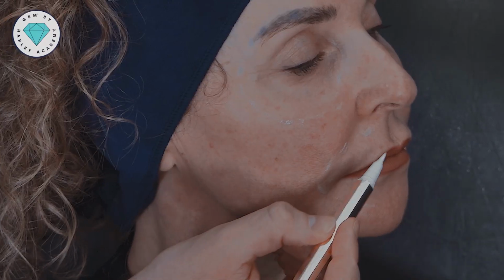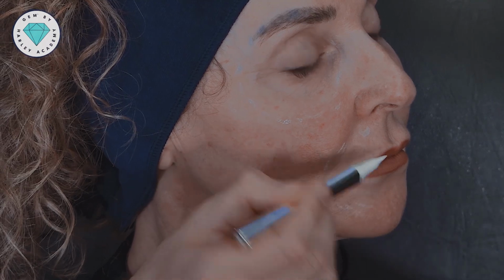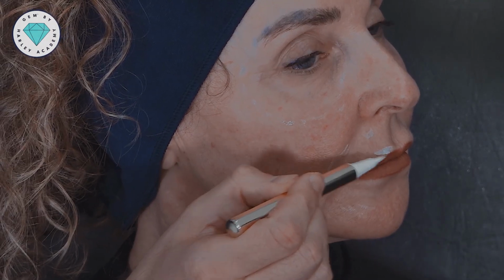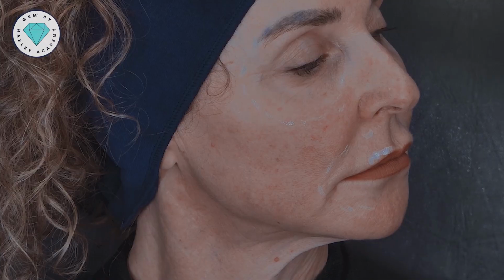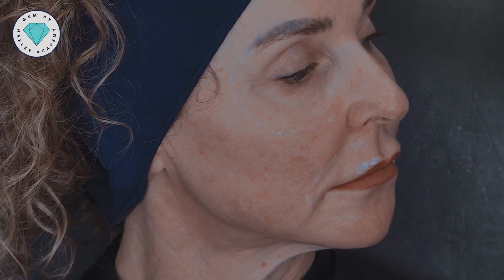You can see here in the upper lip that the filler has moved beyond the vermilion border, and we have a little bit of a ridge coming across the upper lip like this. And on frontal view, often this looks like increased height. When patients look in the mirror, perhaps they don't see this, but when we're assessing our patients in clinic, it's really important to also see them from the lateral view.